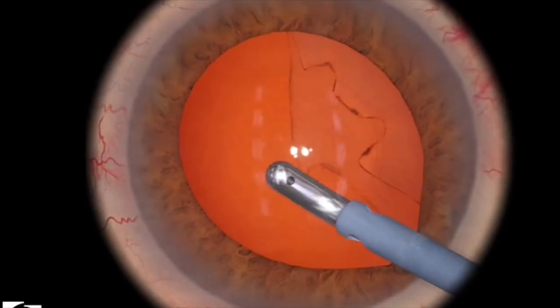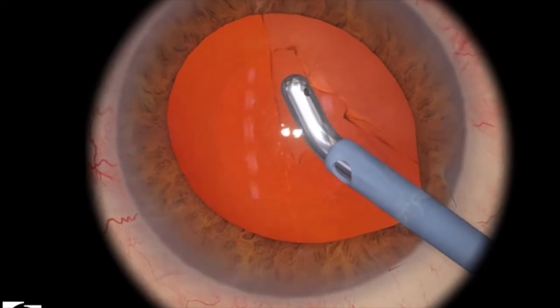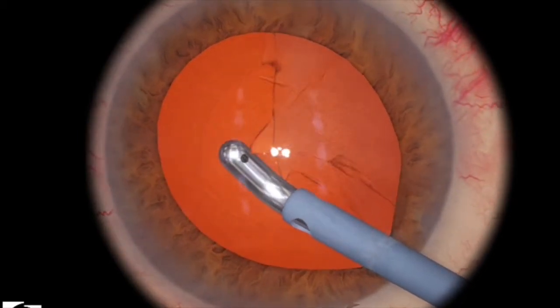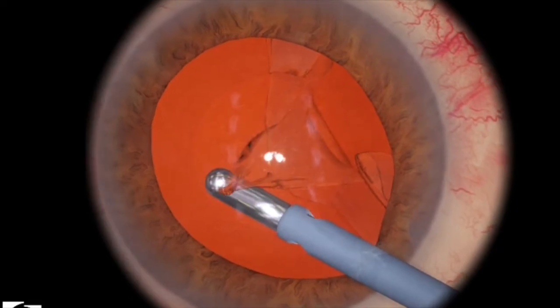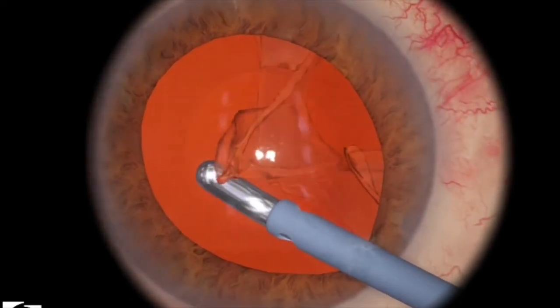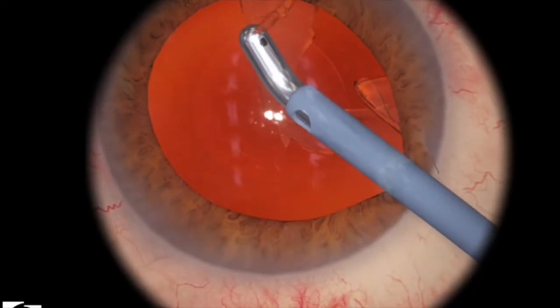Just in terms of settings, if you go into OR Machine and then put on Irrigation as Continuous — I find it easier than reminding myself to always put on the foot pedal position 1 when entering the eye.